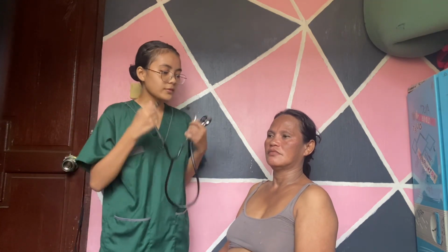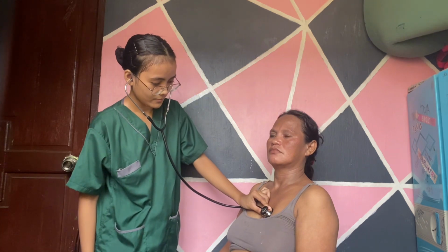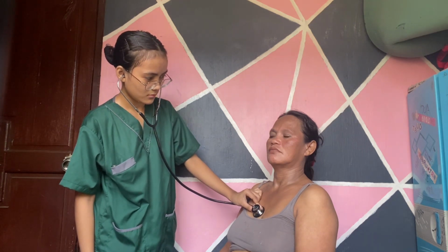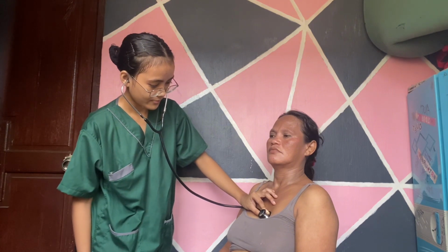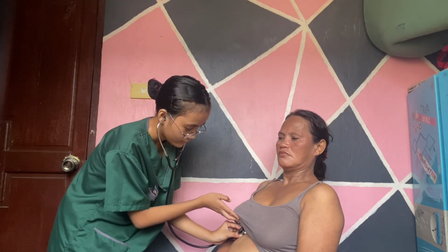Next, I will be auscultating for the extra heart sounds. So this is to listen for any clicks or murmurs. So we'll start at the aortic, here, the pulmonic, the base of the heart, and the apex of the heart again. Okay, so I don't hear any murmurs or clicks.